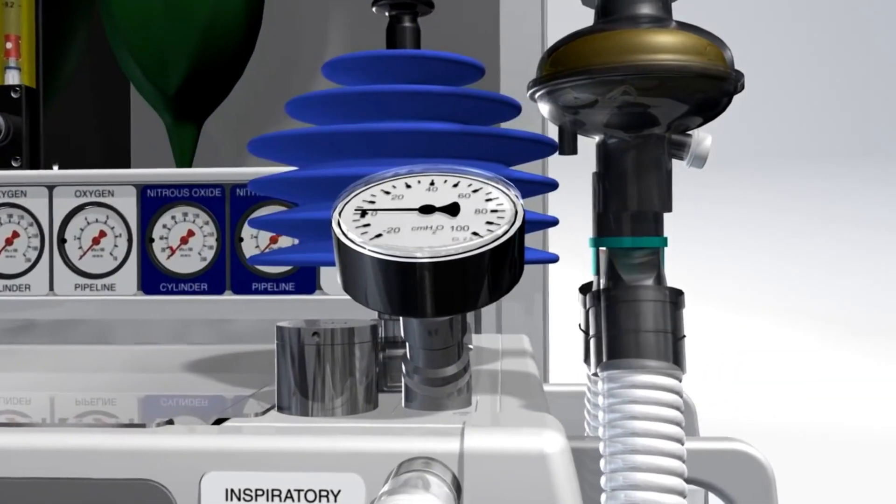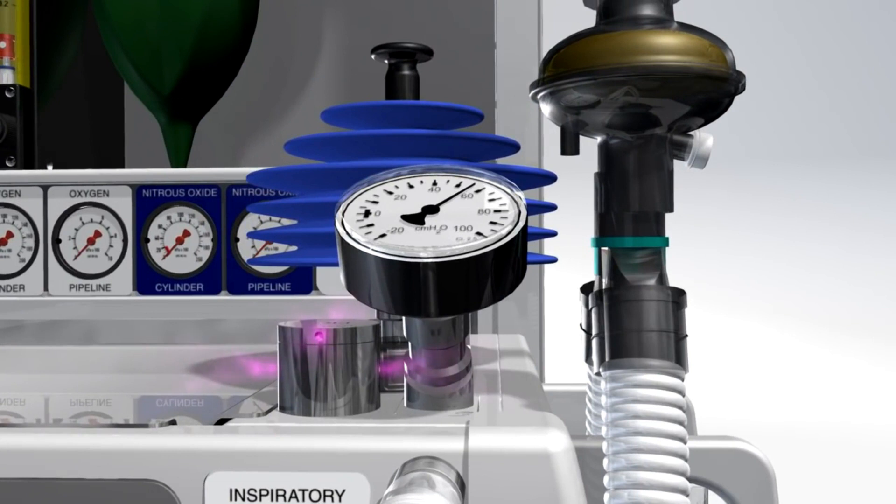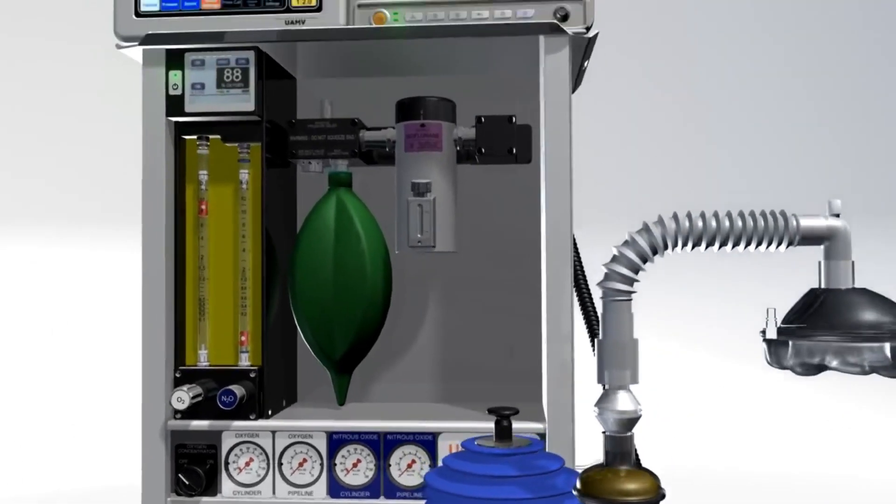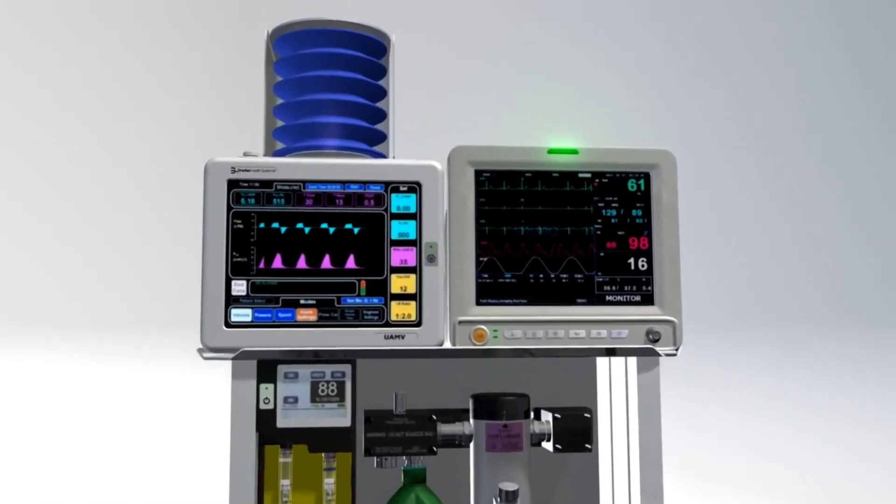Because the performance of the vaporizer is so variable, accurate calibration is impossible. However, many designs have a lever which adjusts the amount of fresh gas which enters the vaporizing chamber.